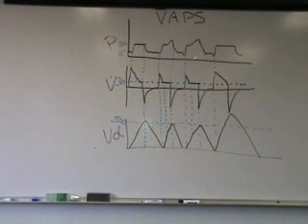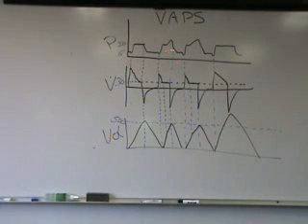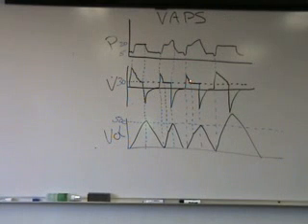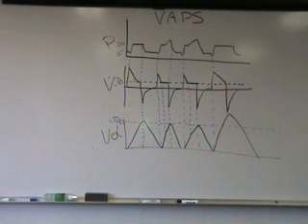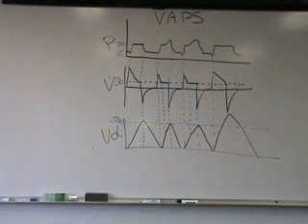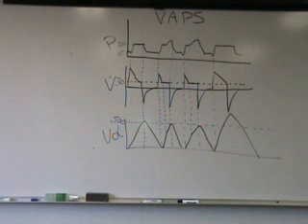Breath 3 is an exact same illustration of breath 2, in which the patient triggers, decelerating flow rate comes down to your set flow rate, the ventilator checks to see if the volume was achieved, volume was not achieved, flow rate continues until the volume is achieved, and then the breath shuts off.